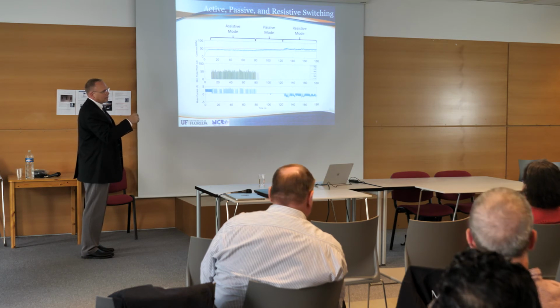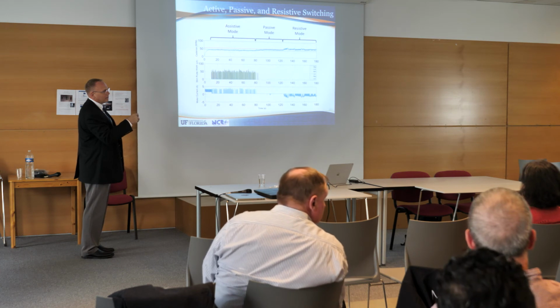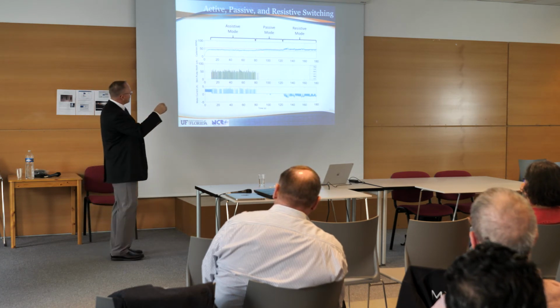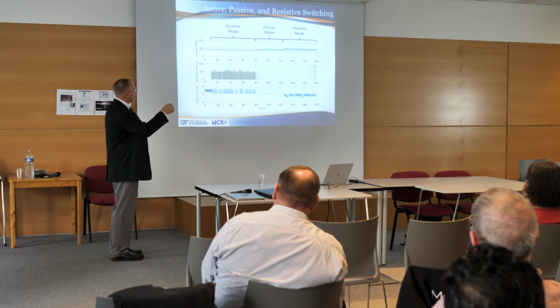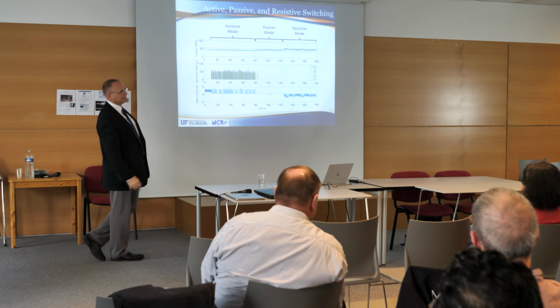Okay, in the beginning I was thinking that if he's trying to do something, then stimulation should bring you up to the orange line, but actually it's just supposed to bring you up to the minimum. Yeah. And then we asked them to pedal, and they were able to stay in here, and then there's nothing on, and then they hit the upper threshold, and that's where it started fighting against them. Okay, now I got it. Okay.